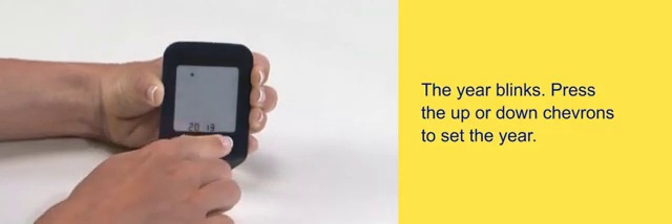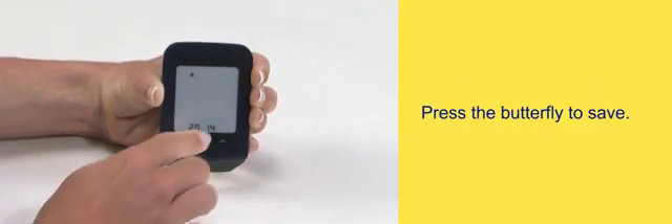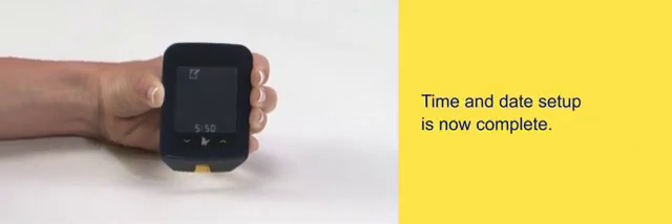Press the up or down chevrons to set the year. Press the butterfly to save. Time and date setup is now complete.